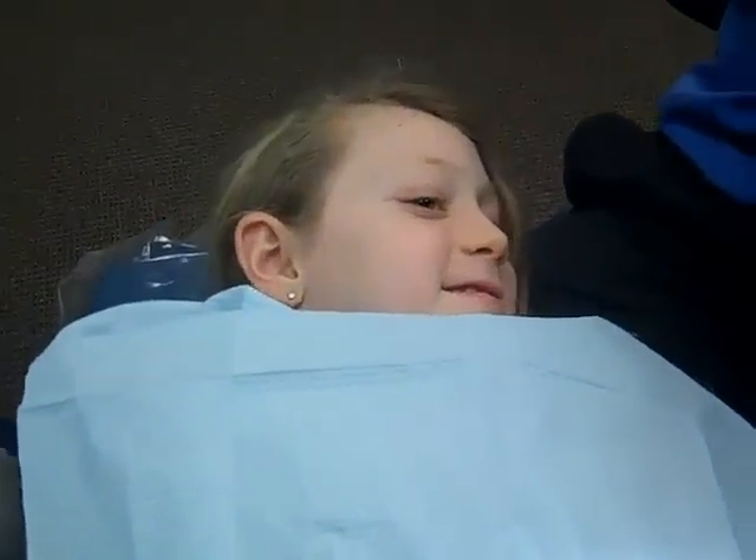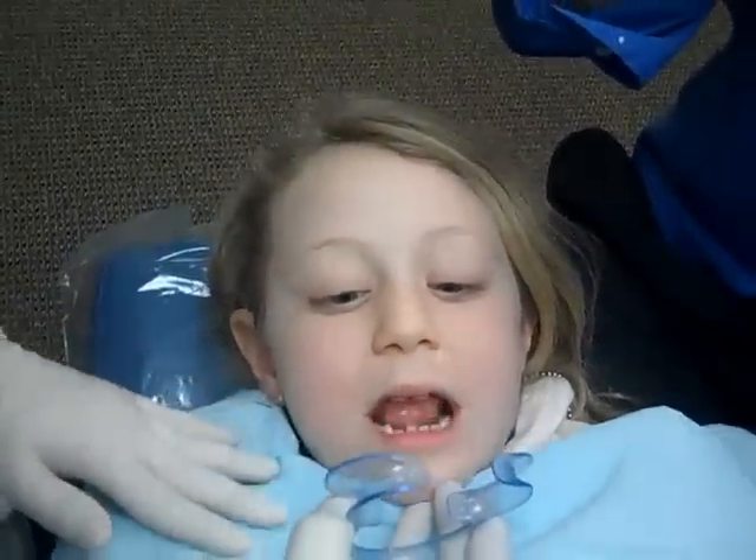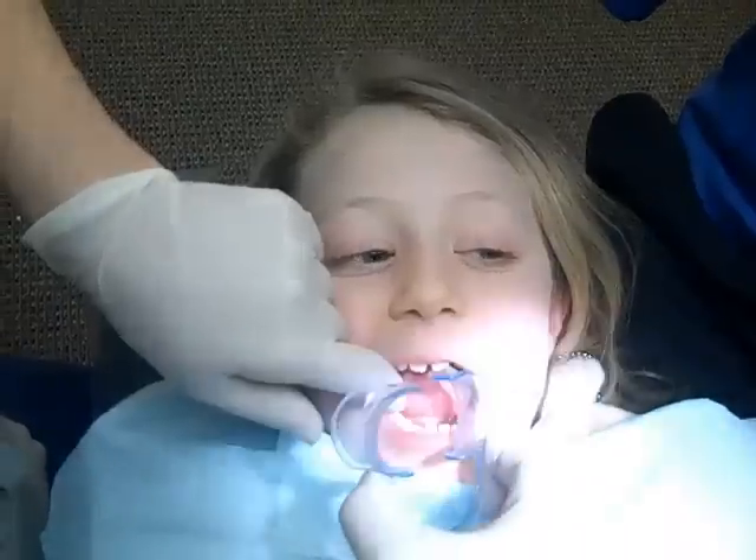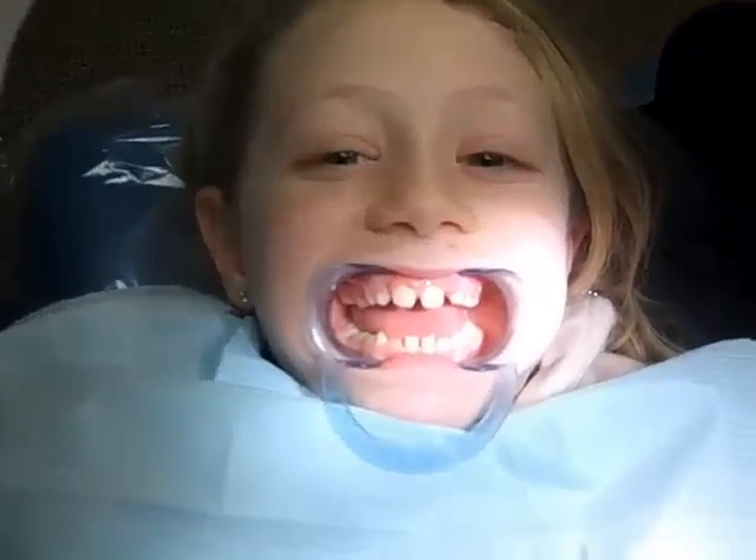Can I have the cheek retractor? This is going to go in your mouth to push your lips away from the teeth so Dr. Clark can work easily with your teeth. Open. You're going to look funny — rawr, big mouth.